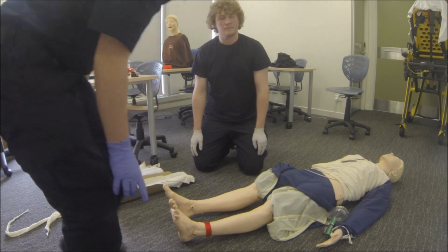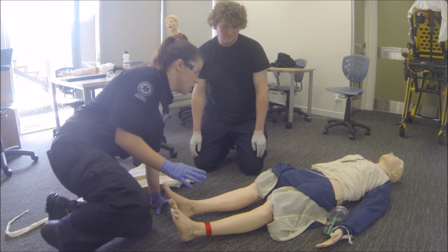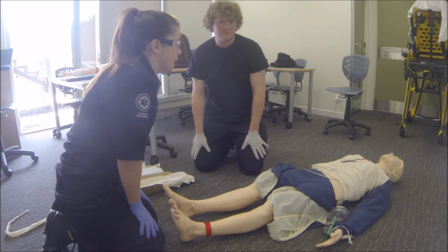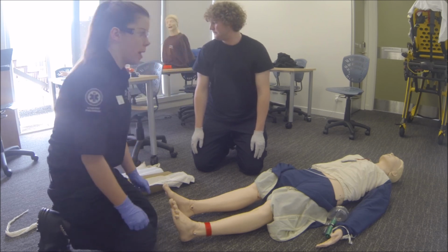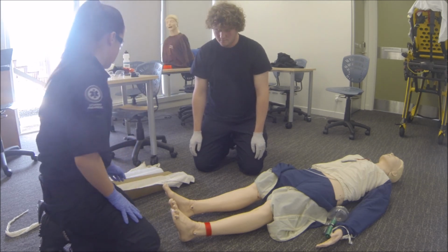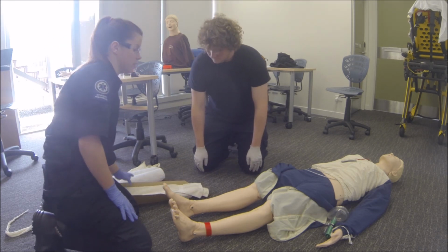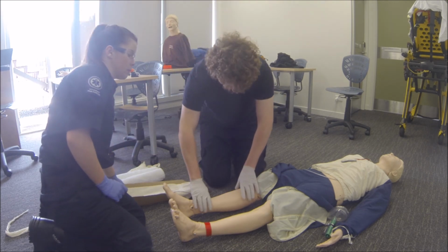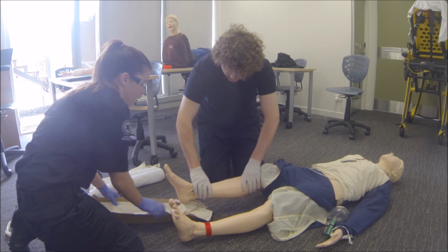Okay. So now that the patient has had some time to take pain relief, I'll just check that the pain relief is working. So on a scale of 0 to 10 again, what would you say your pain is now? About a 3 or 4. Excellent. So now that the pain relief is working, we're going to use a splint. So with this box splint, my offsider is just going to lift the patient's leg up above and below the injury, and the purpose of using the splint is to immobilize above and below the injury. Okay.